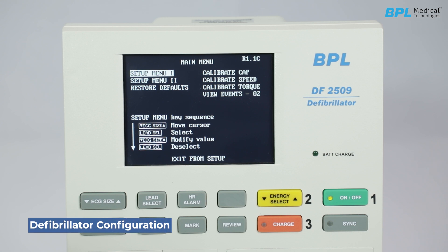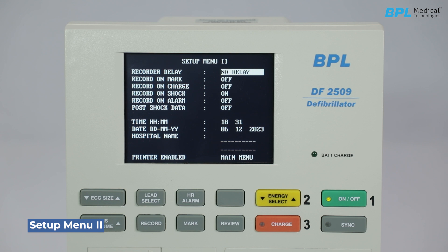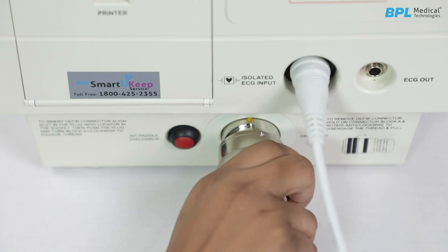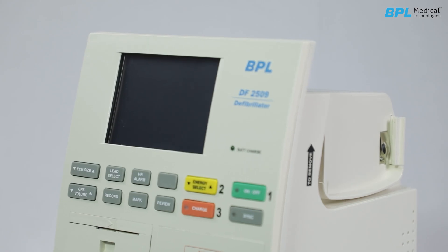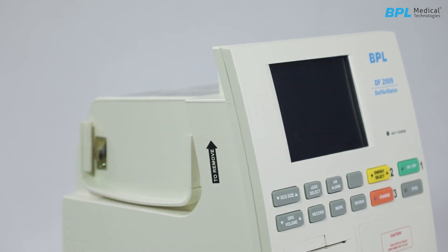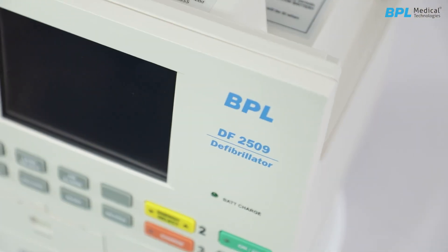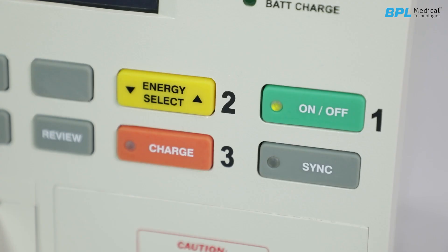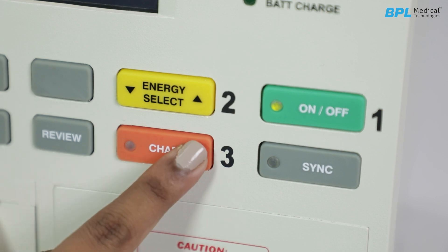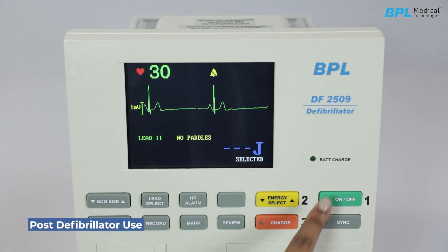Defibrillator configuration — system setup. Disconnect the external paddle HV connector from the unit's front panel. On powering up, the default internal paddle energy is 20 joules. Use the energy select keys to choose the desired energy level; ensure the setting does not exceed 50 joules. Confirm and select the needed energy level, then apply the internal paddle. Press the charge key on the front panel and wait for the charge-ready indicators. Press the internal discharge switch on the front panel to defibrillate. Turn off the unit using the on/off key.